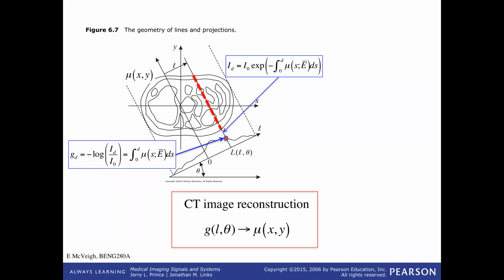Today, we're going to cover the big three items in computed tomography, and that is the Radon transform, the projection slice theorem, and convolution back projection. This is the foundation of CT, the Radon transform being the math, and then the projection slice theorem being a realization of what these projections mean, and then how do you make a picture using your raw data, and we'll see that that's called convolution back projection.